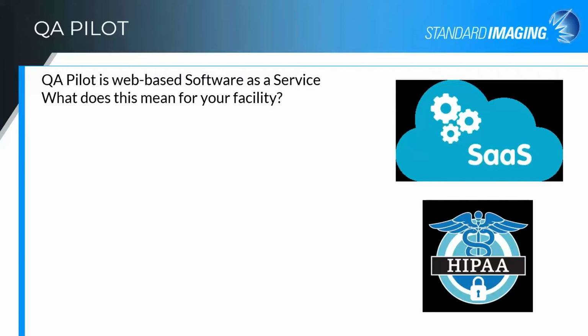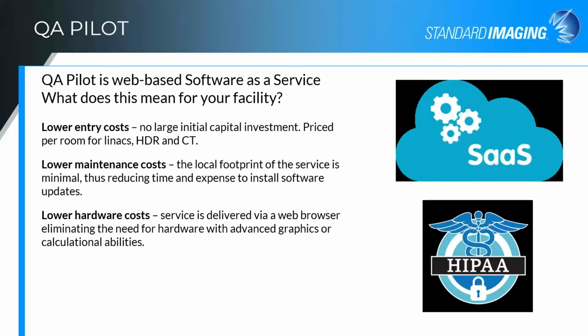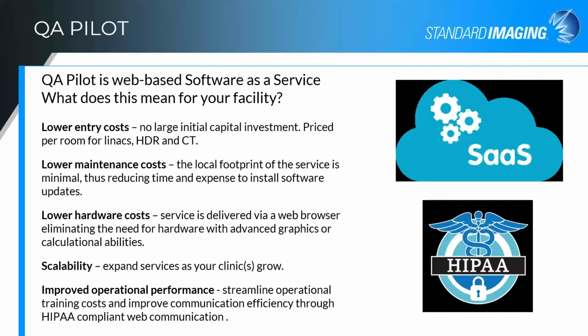It is also important to note that it is provided as a software as a service model, and this translates into lower entry costs, lower maintenance costs, scalability, and data security.